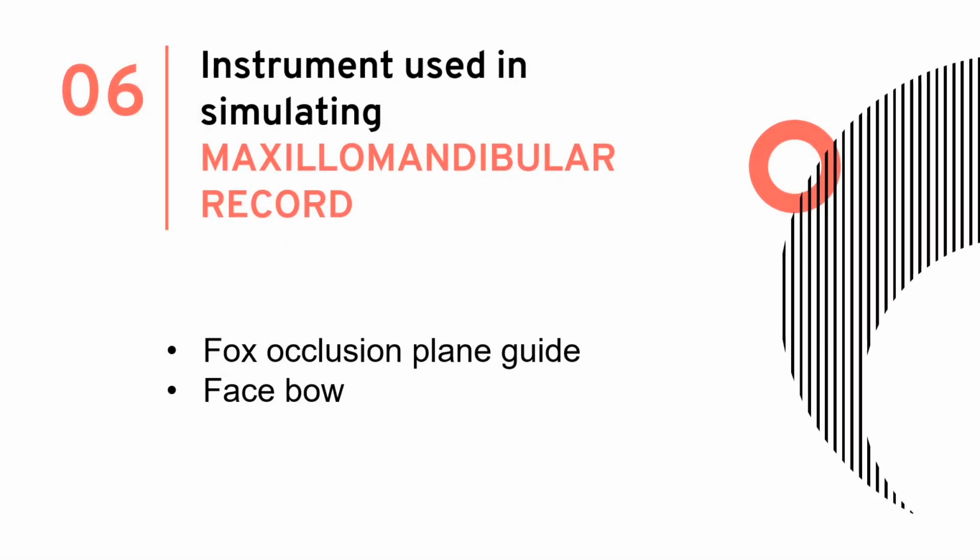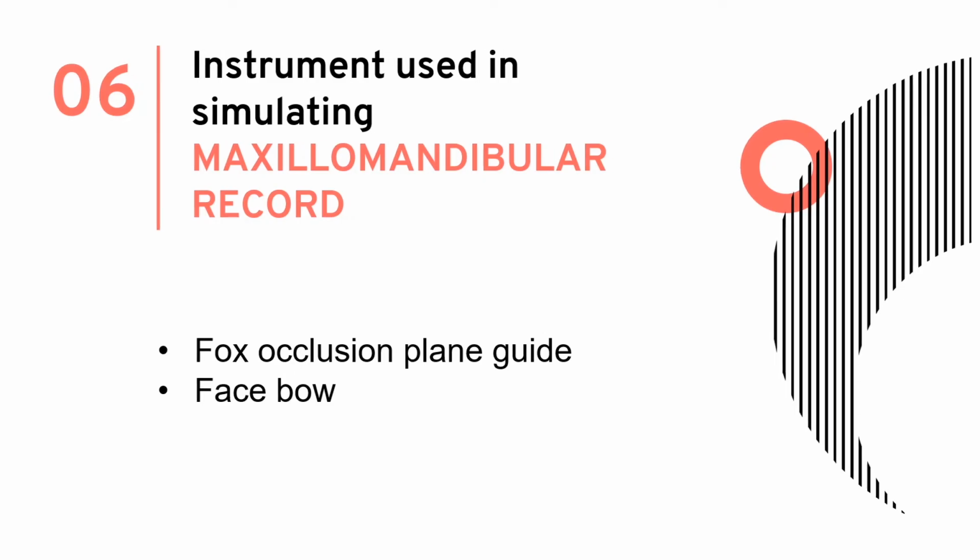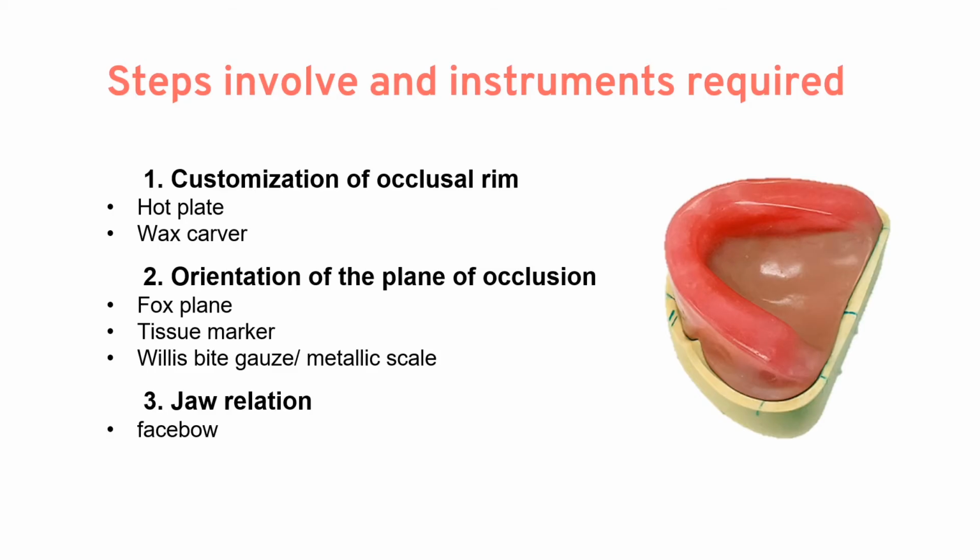Till now, we have fabricated the denture base and prepared the occlusal rim. Now we will be recording jaw relation. For this purpose we require the Fox occlusion plane guide and face bow. Steps involved and instruments required: for customization of the occlusal rim, we will use hot plate and wax carver. For correction of orientation we require the Fox plane, tissue marker, and metallic scale. And for jaw relation, we do need a face bow.